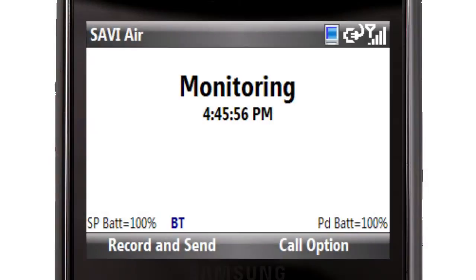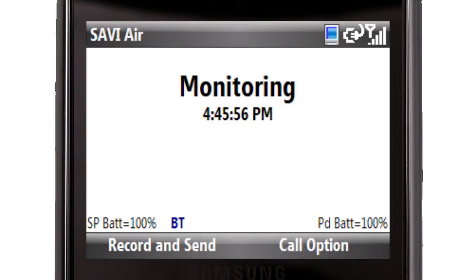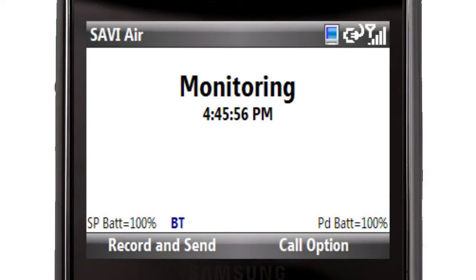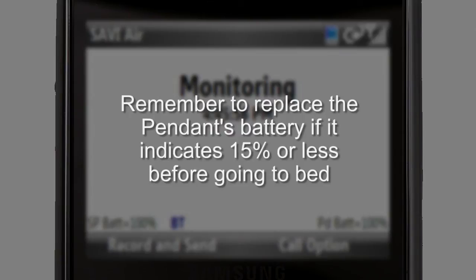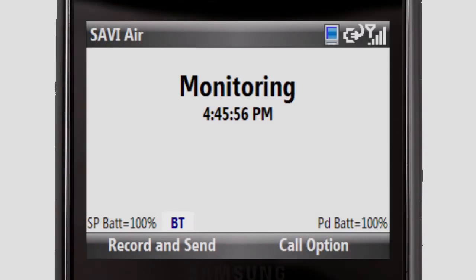On-screen power indicators. You will notice some indicators across the bottom of the smartphone screen. SPBAT indicates the percentage of smartphone battery remaining — 100% means fully charged, and the percentage decreases in increments of 20. The smartphone will alert you when it needs to be charged. PDBAT indicates the percentage of pendant battery remaining. You should replace the pendant's AA battery when the smartphone alerts you, or when PDBAT indicates 15% or less when going to bed. You may also see BT, which means the smartphone and pendant are connected via Bluetooth. If you see ECG data flashing or constant, this means the pendant is sending ECG information to the smartphone. It is normal to only see ECG data flashing once in a while, as the pendant automatically sends data to the smartphone periodically.